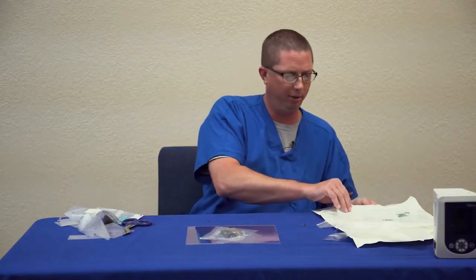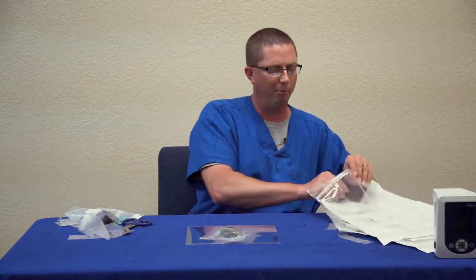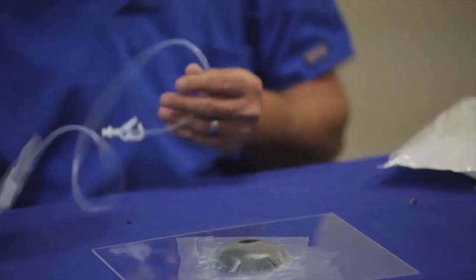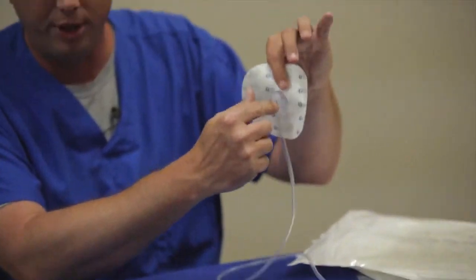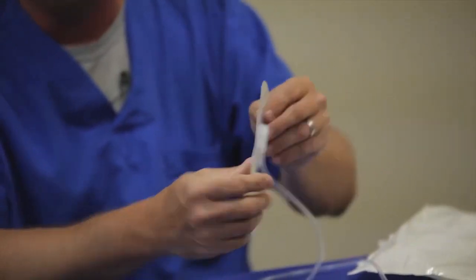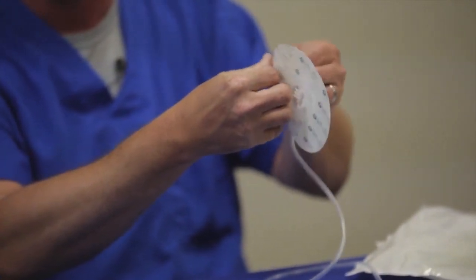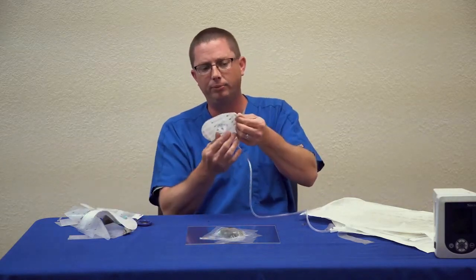From here, my negative pressure kit, I'll remove my port pad. The port pad is clear. You can see through it, so you can line it up exactly over the hole that you just placed. You remove the number 1 tab first from the back side, exposing the adhesive.